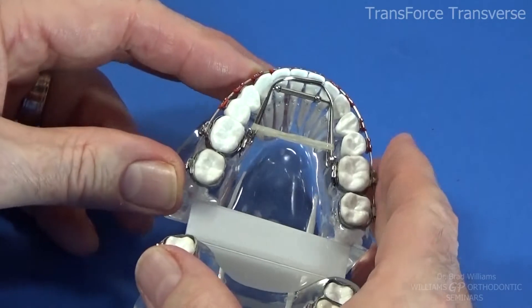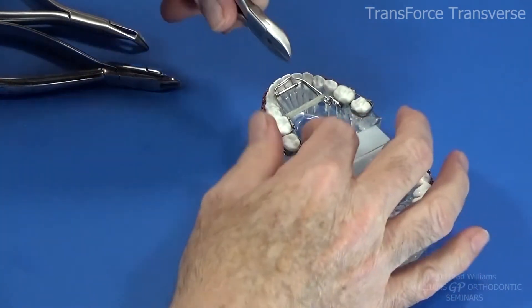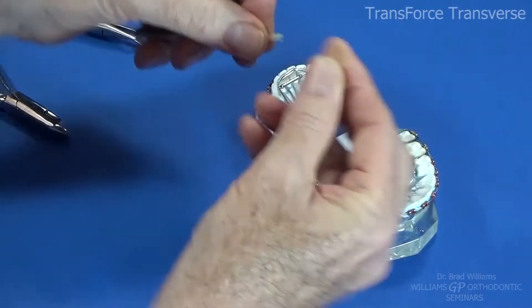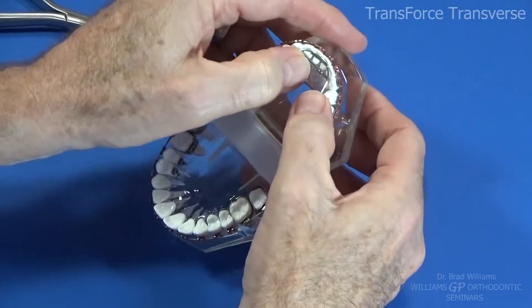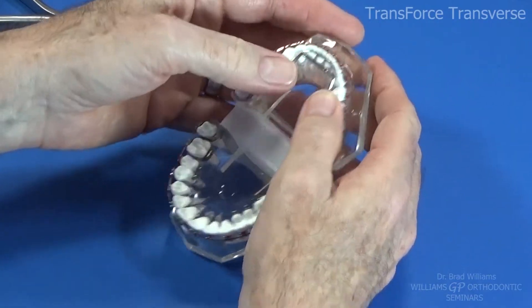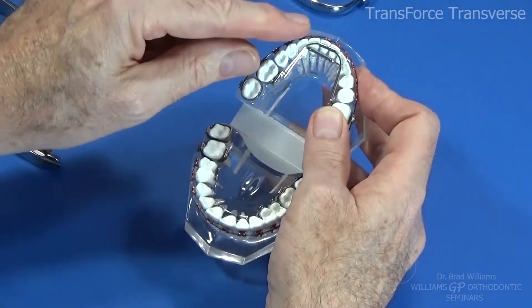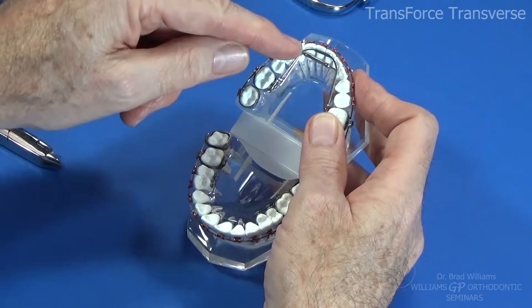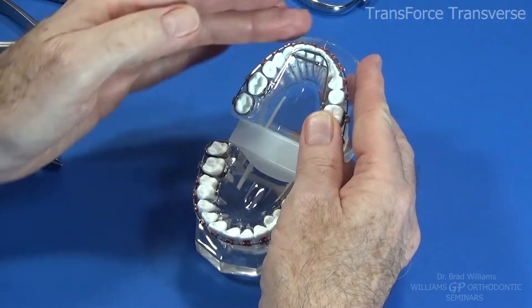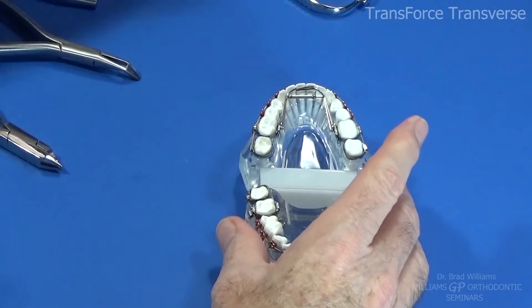Once it's fully inserted, the next step is to tie it in. First, I'll take a pin and ligature cutter and cut these elastics. Now it's active — it's trying to spread apart. You can just imagine if this were a utility arch wire out here in mixed dentition with only two incisors in and two blocked out. You might have these springs pushing on the lateral incisors, pushing apart to make more arch length so there'll be a place for those teeth to go.